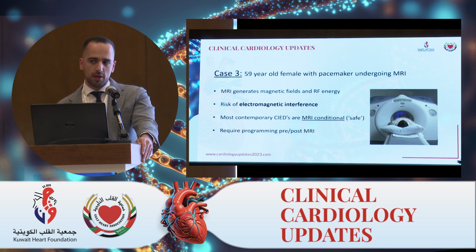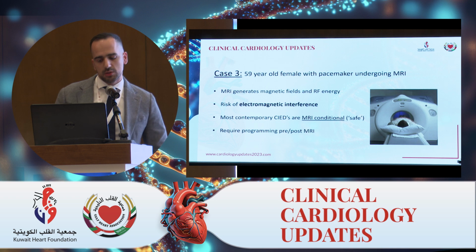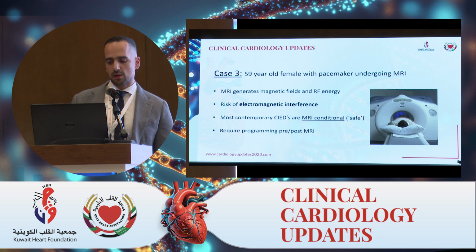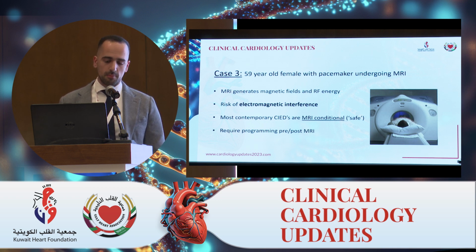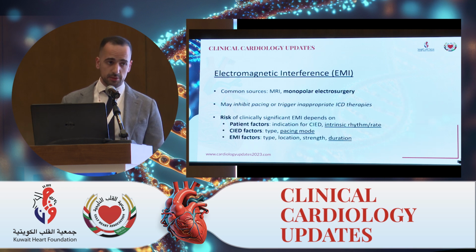You can't get an MRI if you have a pacemaker and ICD. We still sometimes do them, but there was a risk. But now, luckily, most contemporary devices carry an MRI conditional tag in that you can undergo an MRI up to 1.5 Tesla as long as certain conditions are met, as long as the patient doesn't have any abandoned leads, and it will require pre-programming and post-MRI programming. But back to electromagnetic interference.